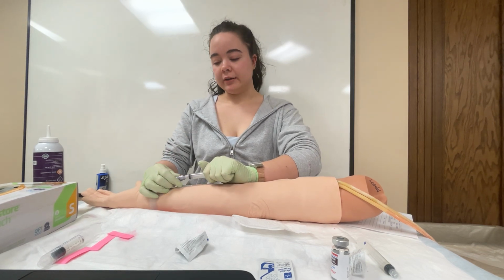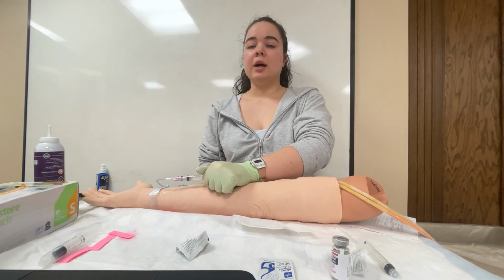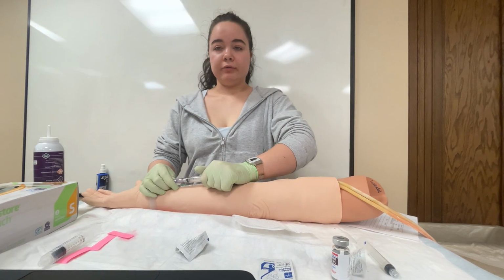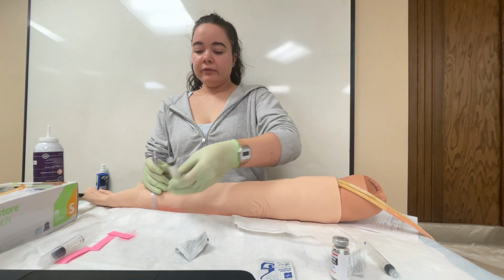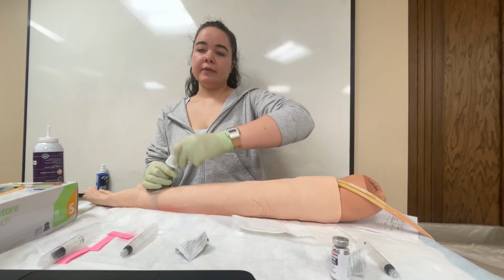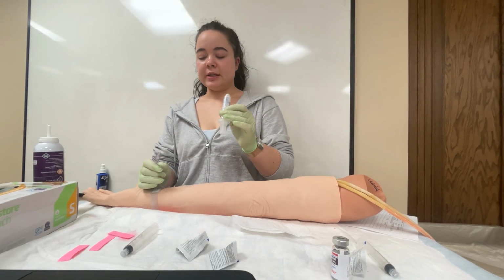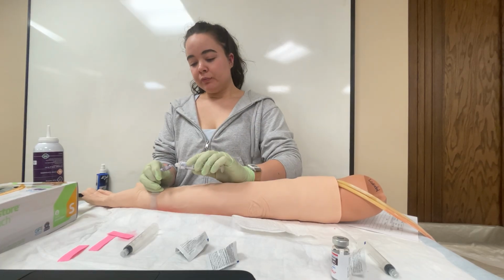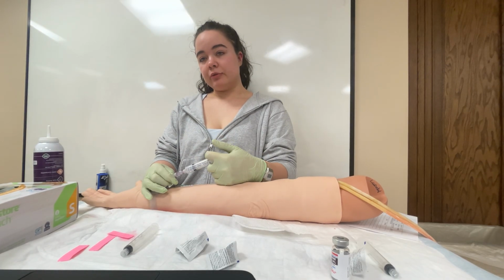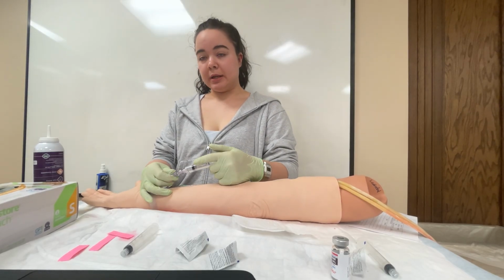So now that I have administered that accordingly, I'm going to be, of course, assessing for infiltration and inflammation, none of which were noted. Take this off. I'm going to go ahead and clean again. 1, 2, 3, 4, 5, 6, 7, 8, 9, 10. I have another normal saline flush pre-filled. I'm going to be injecting my 3 milliliters normal saline at the same rate that I administered my medication.